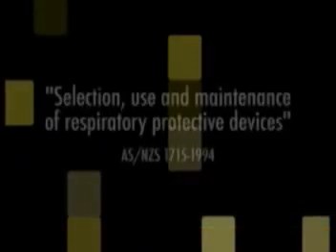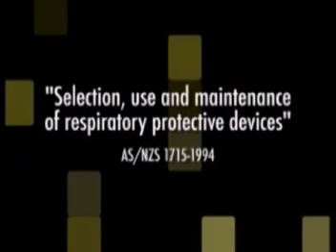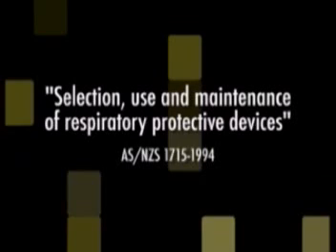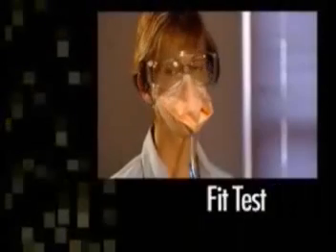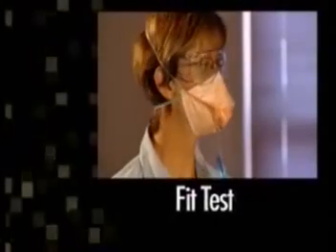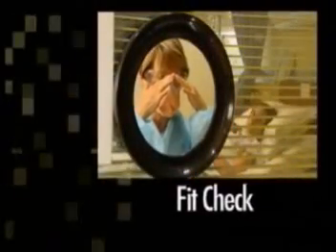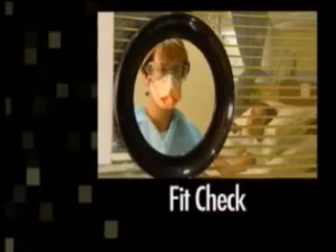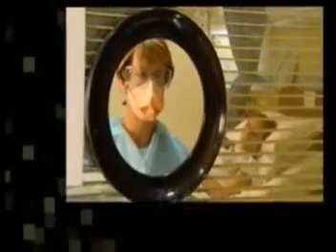The Australian New Zealand standard for selection, use and maintenance of respiratory protective devices advises employers to provide a fit-testing process. Fit-testing is a validated method of matching a specific respirator mask to an individual face. A fit-check is a quick check to ensure the mask is fitted correctly at the time of use. Fit-checking does not negate the need for a fit-test.